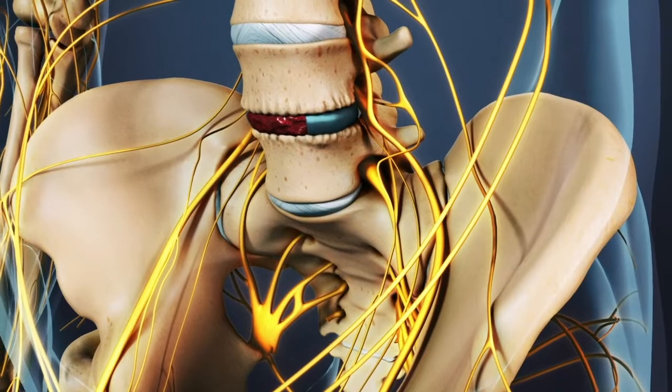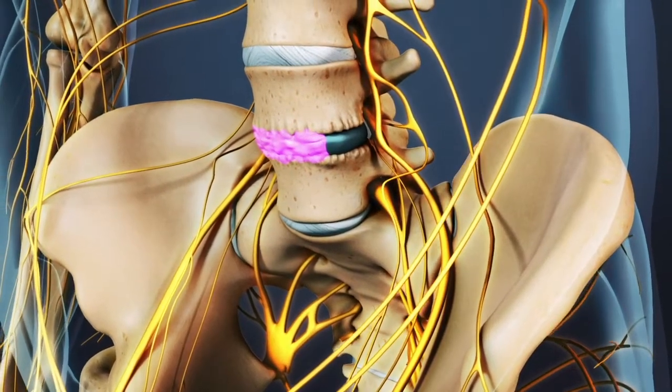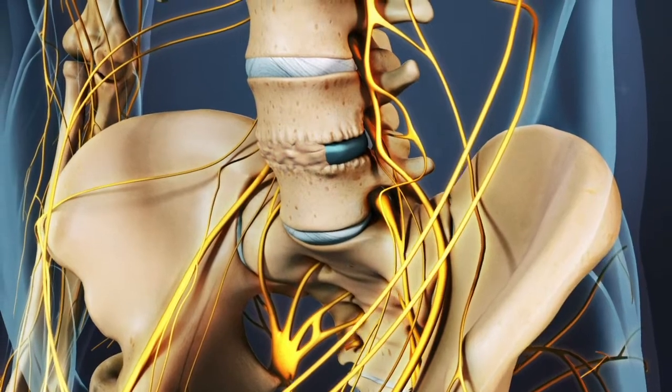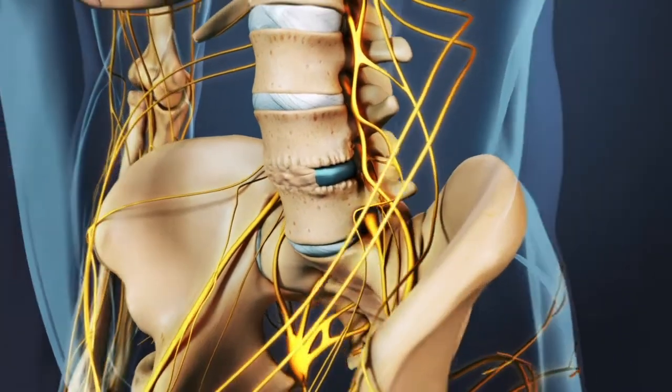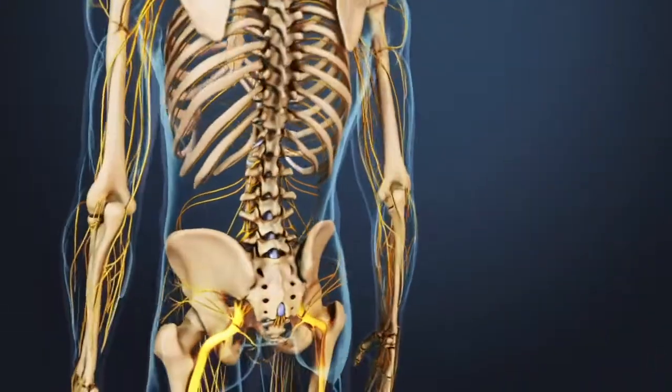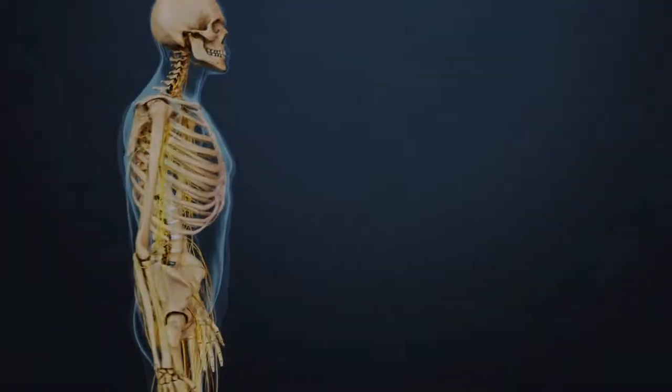In the months following the surgery, the bone graft heals together through and alongside the cage, creating one long bone between the vertebrae and immobilizing that segment of the spine. An ALIF may be combined with a simultaneous posterolateral fusion, with an approach from the back of the spine, if additional stability is needed to help ensure a successful fusion.